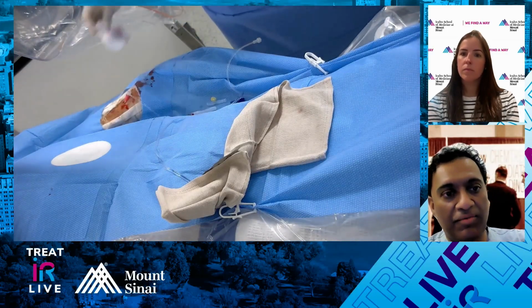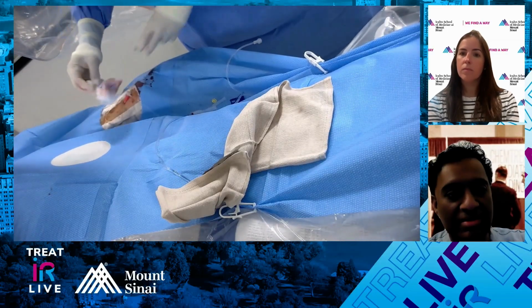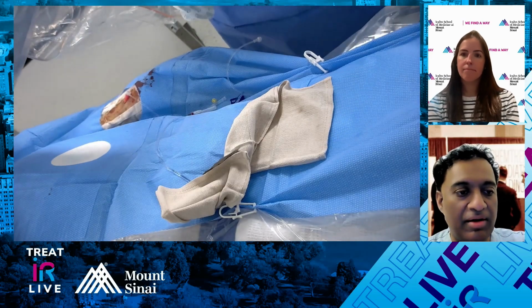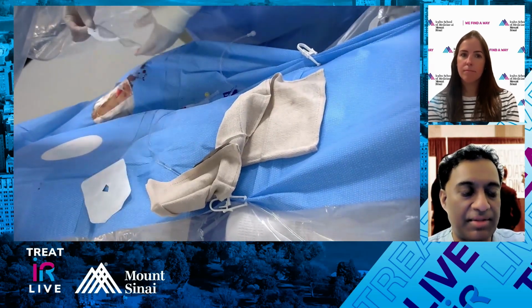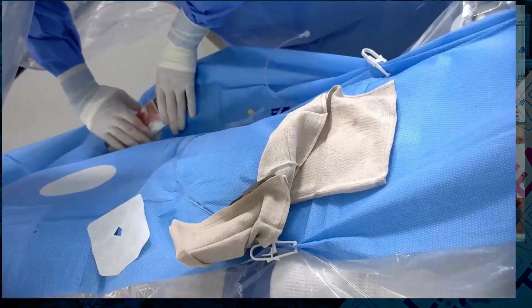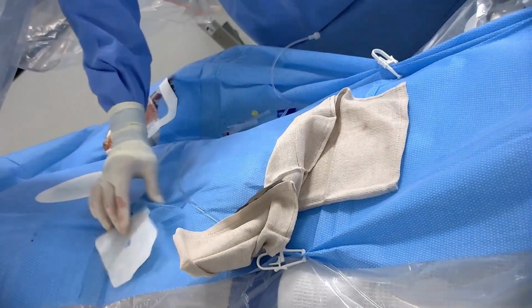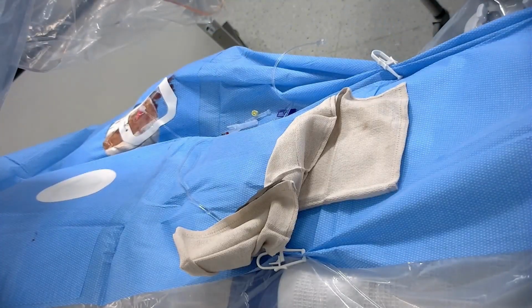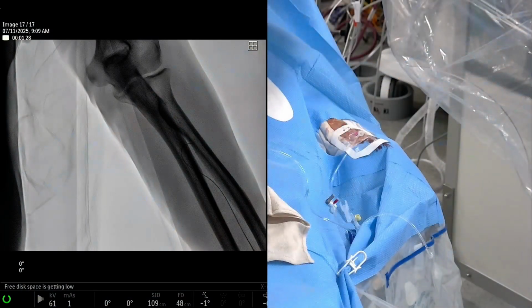Can I get a forceps or radial put a VBX stent into the internal? That's another option for repair if you want to preserve the hypogastric. But his limb is 12 millimeters, right? So it would be really hard to put an iliac branch in that. Not enough space. I don't know if you guys can see the 14 to 15 to do that, but I agree. 12 is too small.